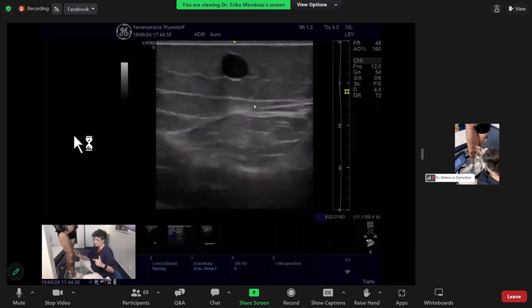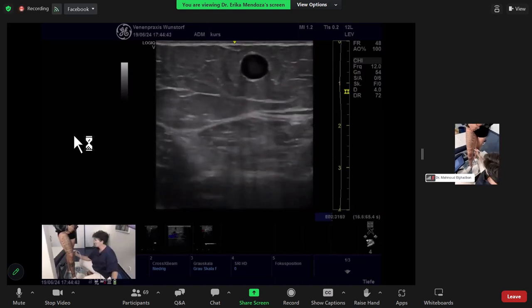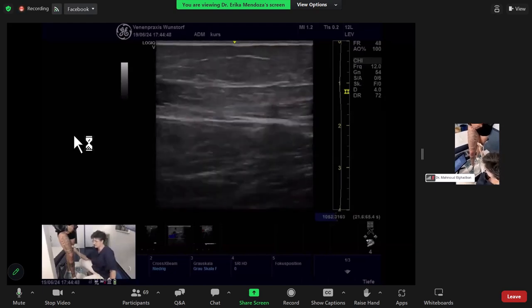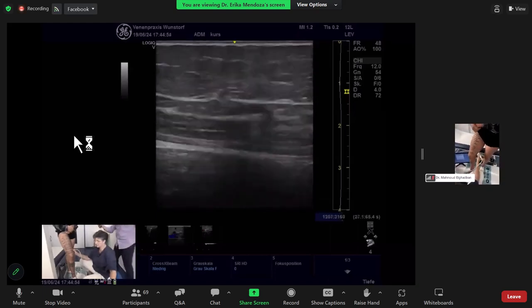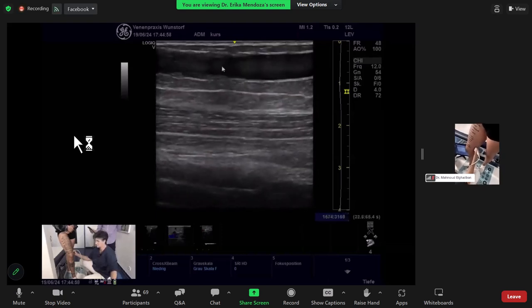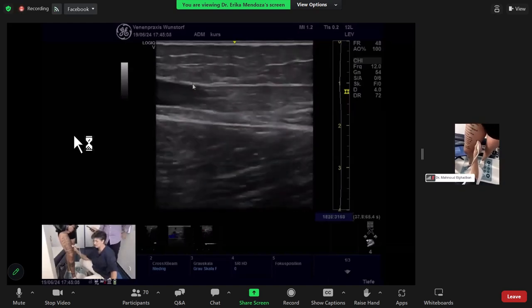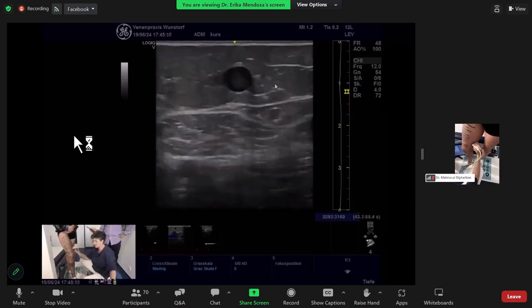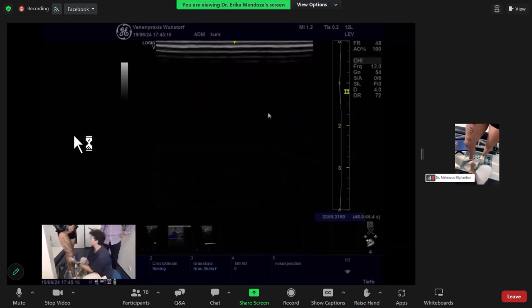And in this case, you can do that also with endoluminal laser. Normally the tributaries are tortuous, but in this case it is a very straightforward tributary. You can put the needle inside the tributary like here, introduce the needle, go up with a laser device until this point and close here, so that you leave the great saphenous vein draining. This is one of the best situations for CHIVA.